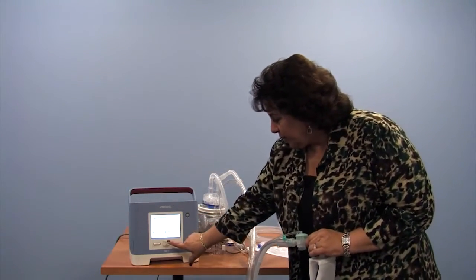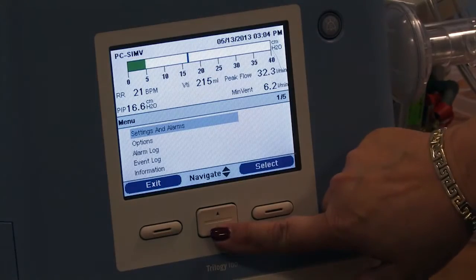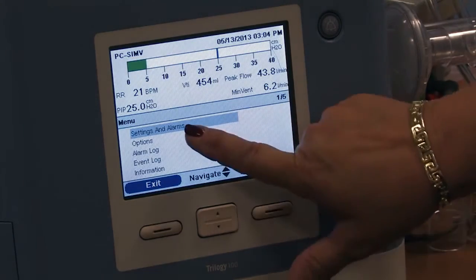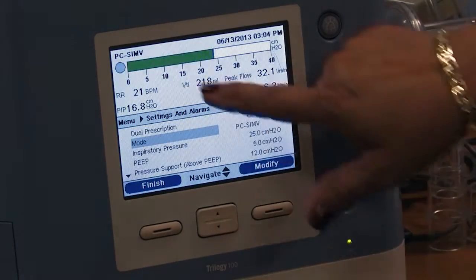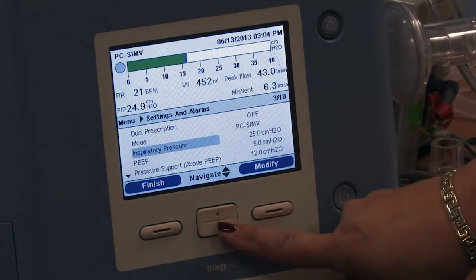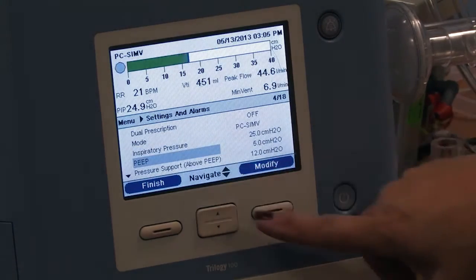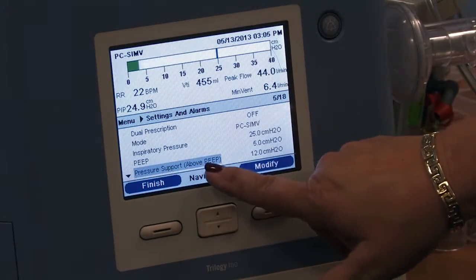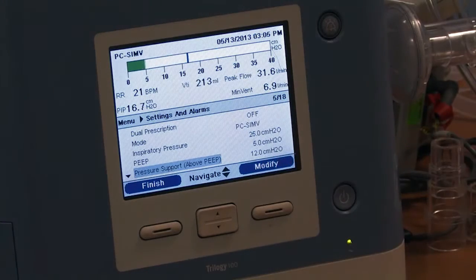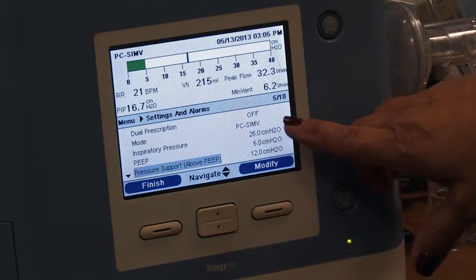So that means that when I look into the menu, the up arrow is the menu, and I look at settings and alarms and select them, I can see that the mode is pressure control SIMV, as it states up top. This patient has an inspiratory pressure setting of 25 centimeters of water, PEEP or end expiratory pressure of 5, and pressure support, which it states for you as above PEEP, is 12 centimeters of water.